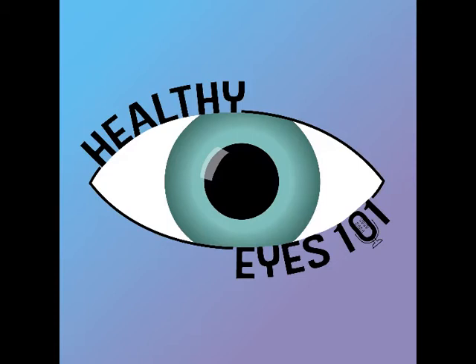Hello, I am Dr. Stephen Su, a board-certified ophthalmologist, and I would like to explain the various steps of cataract surgery so that you, as the patient, can understand the operation that will help you regain your sight.